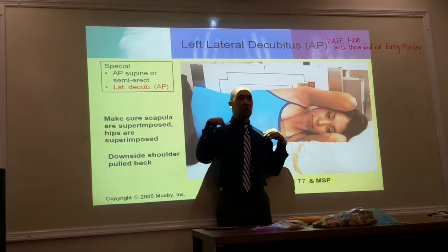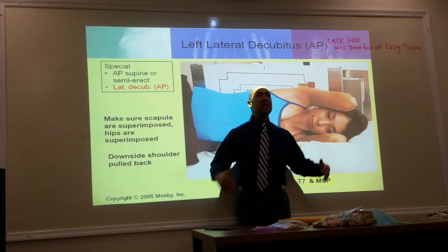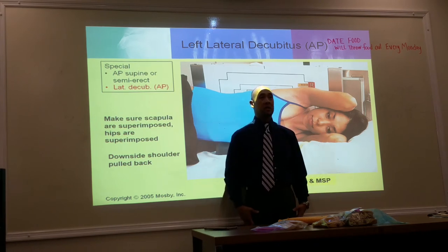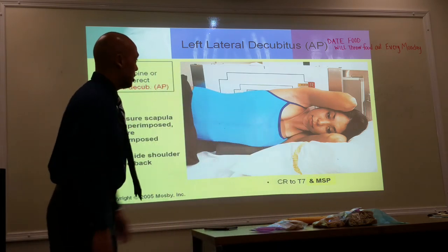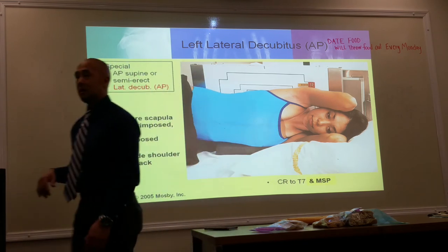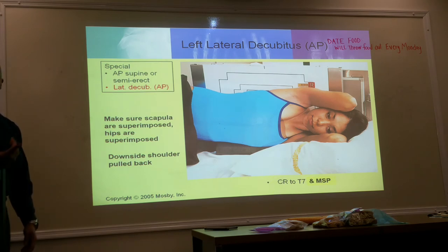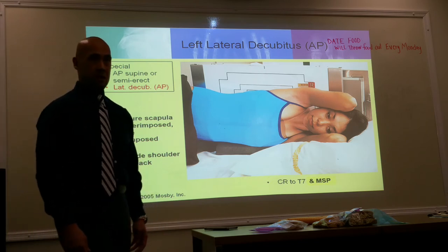When they're on their side, again, just like any other chest x-ray, make sure there is no rotation of the shoulders. There is no rotation of the hip. We want to keep it one unit from here to here with no rotation. Any rotation of this or the hip can change the overall look of your radiographic image. So maintain the hips and the shoulders in the same plane. Okay? Take a deep breath in, blow it out, take another deep breath in to make your exposure.